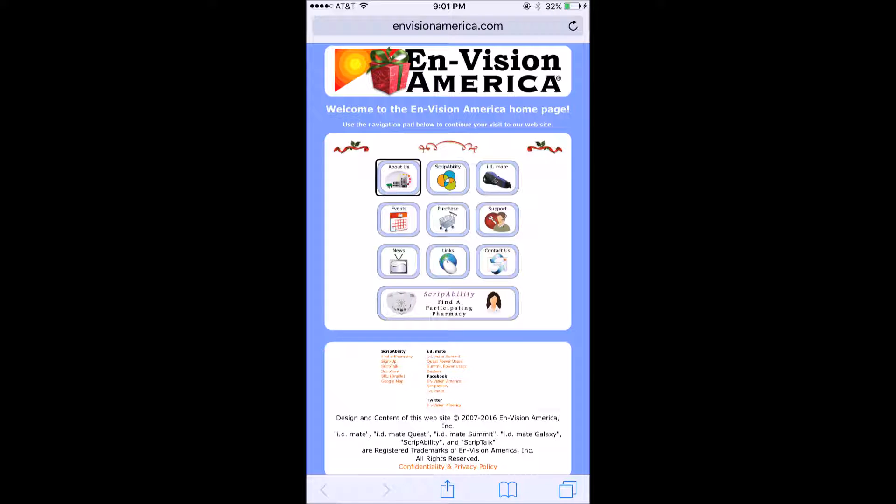If you have a loved one who needs this type of technology — where you can have your medicines read out loud to you — ScriptTalk by Envision America is the best way to go. It's a super wonderful unit and it works really great, especially for people with low vision. This is Jose Tamayo for the Blind Tech Channel — if you have any questions, please feel free to post them below.